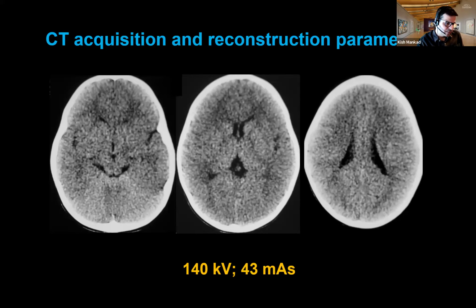Remember, everyone in the world talks about let's reduce the radiation dose, which is fine and very good. But with modern-day CT scanners, the radiation dose is not a significant penalty if you look at the risk-benefit analysis. You can get away with about 2 millisieverts of radiation, which is significantly less than a transatlantic flight that you would take to go and party in the US.